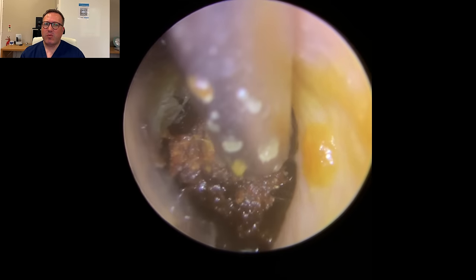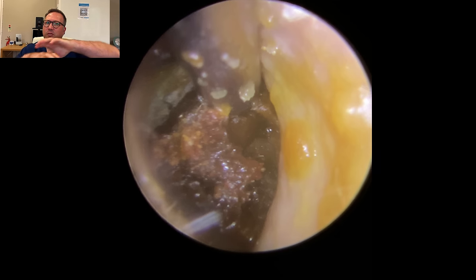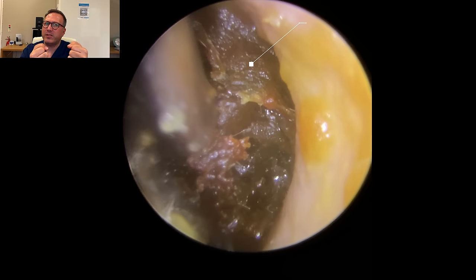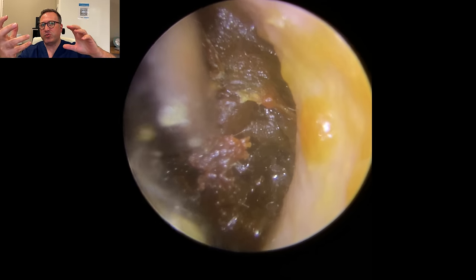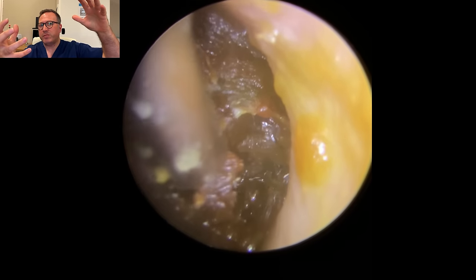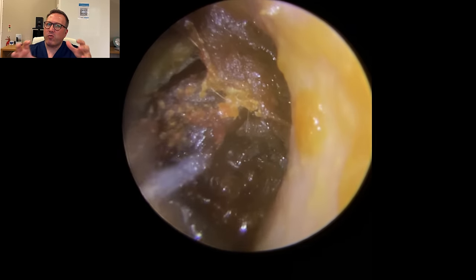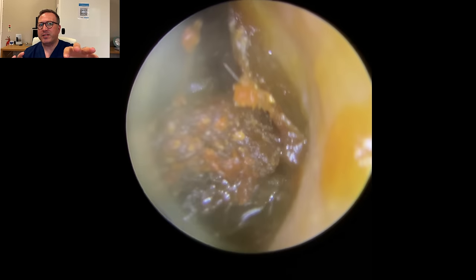You can see we're getting a little bit more movement here. Now what you can see here to the top left is actually a layer of dry skin. It wasn't really visible at the start, but this is dried into the wax. What's happened is it's formed a little sleeve all the way around the canal and dried into the back end of the wax, which is why when I'm pulling it from the front, it's not really moving. And this section in the top right corner - that's another sleeve coming right the way down the canal. So it's holding at the back with this dry skin, which explains why the wax is moving when we wiggle it but not coming down the canal. The suction's not really holding on to it tight enough. You can see all the dry skin layers at the top there.